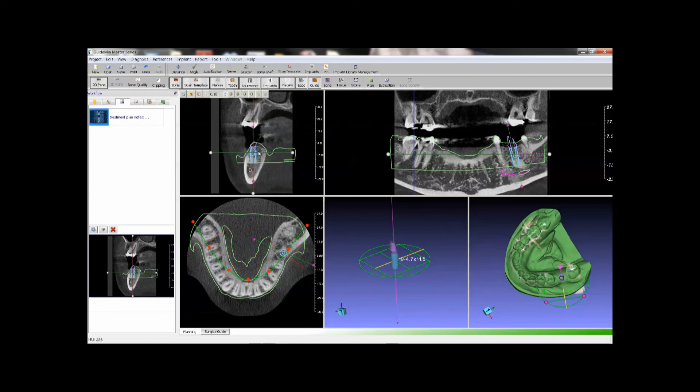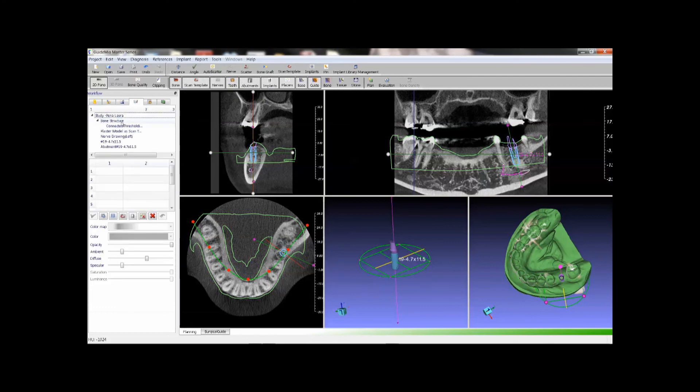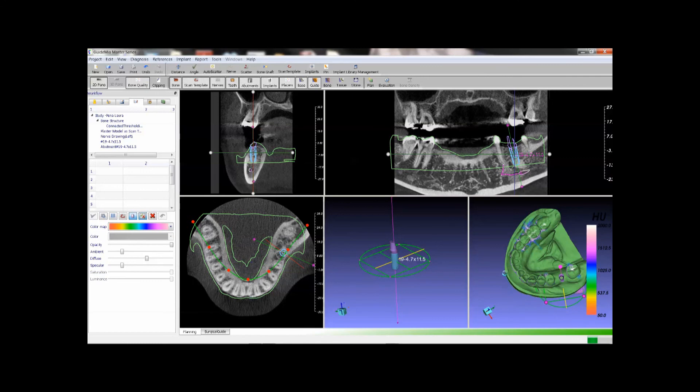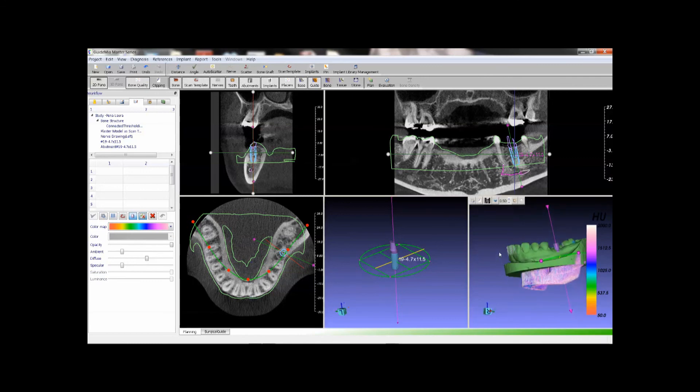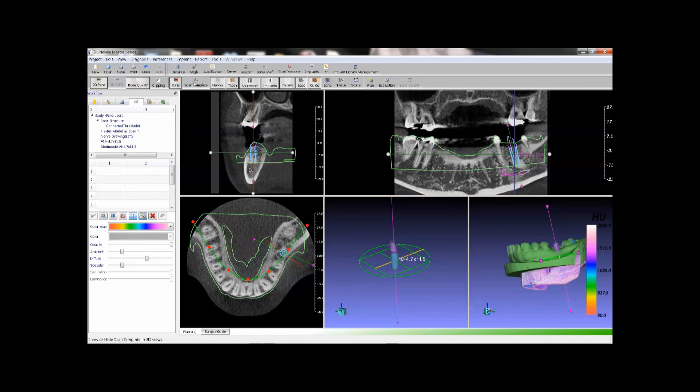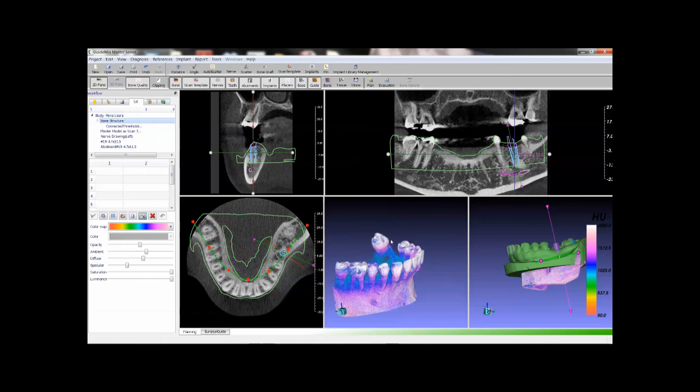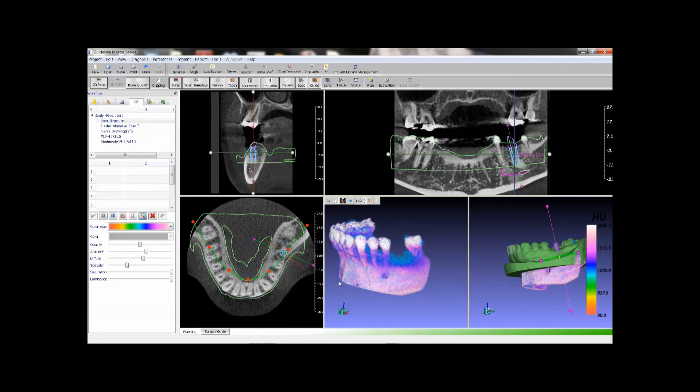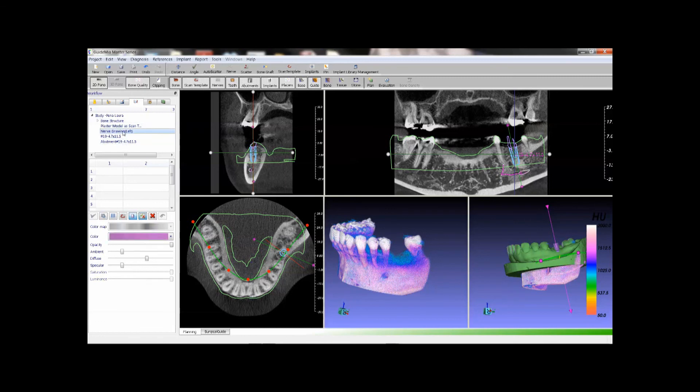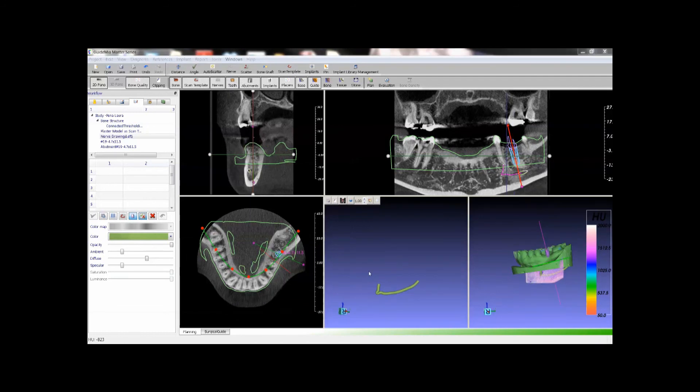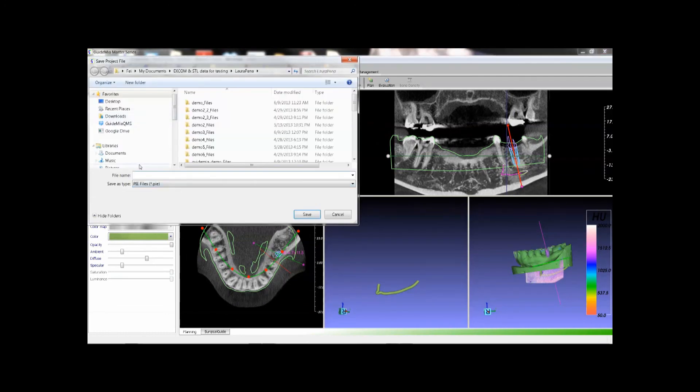Let's take a look at our object navigator. Enter the tool. Select the bone structure from the tree. Change its color map to show bone density. Now the bone rendering is changed to bone density mode. Hounsfield unit values of the voxels are mapped to colors. Double-click on the item. This will make the bone structure our working object. Make the nerve model current. Change its color.